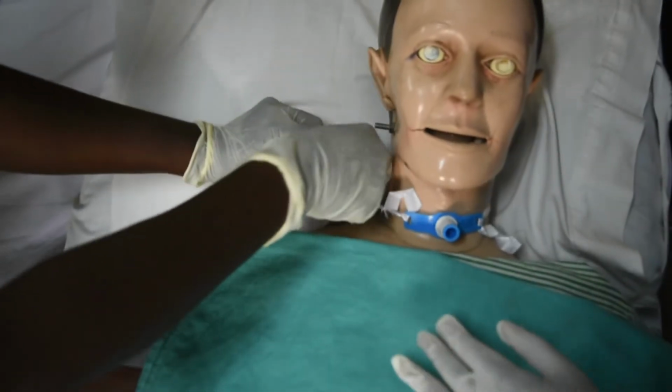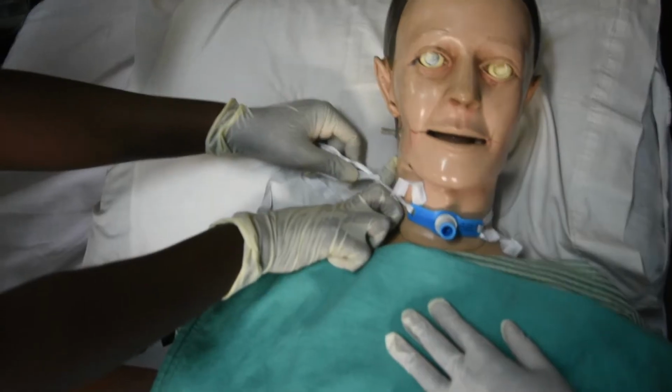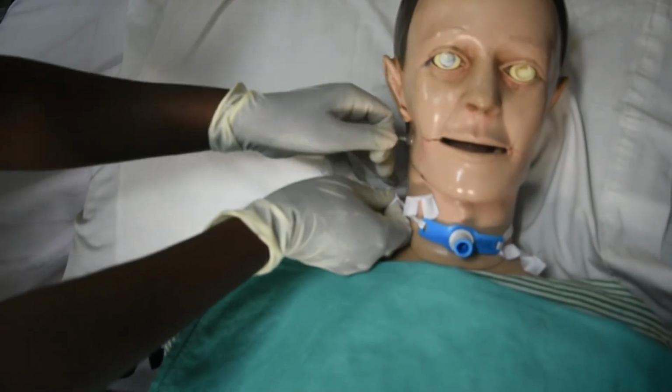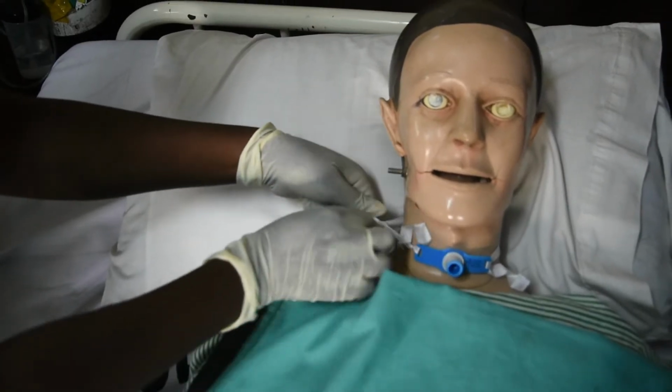We make sure as we are tightening the strings, we pass a finger so that it isn't too tight or too loose on the patient. Mr. Mulago, hope it is not too tight. You tie using a knot.